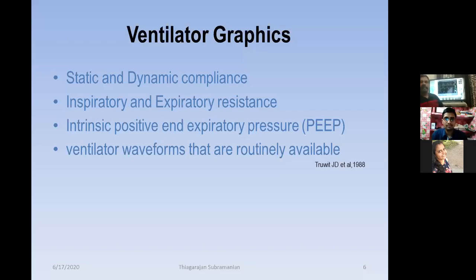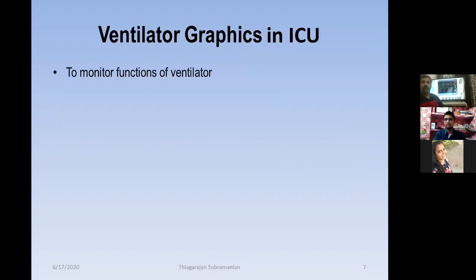So what happened with this situation? They have sent all the questionnaires to the entire hospital, and finally they have found that many kinds of graphical representations in the ICU are used to monitor the function of the ventilator, to set the appropriate tidal volume, to set the PEEP, as well as to find out the flow rate, and to identify the problems and correct them, especially the sensitivity.